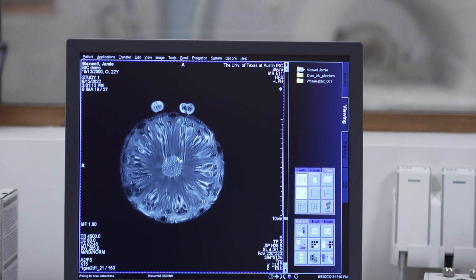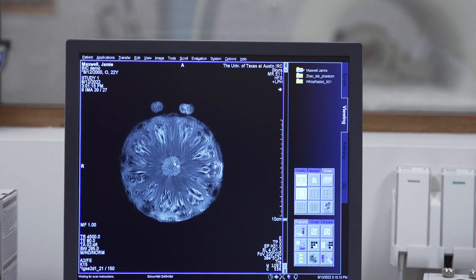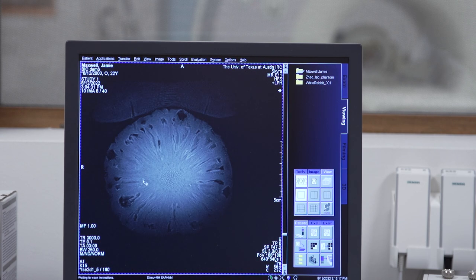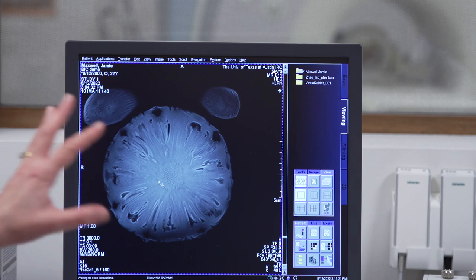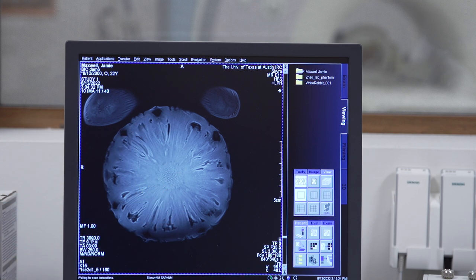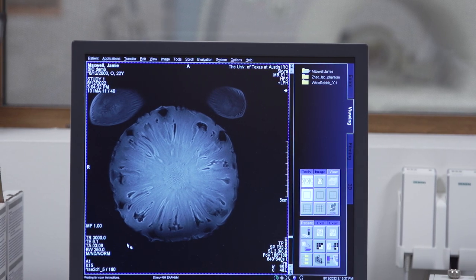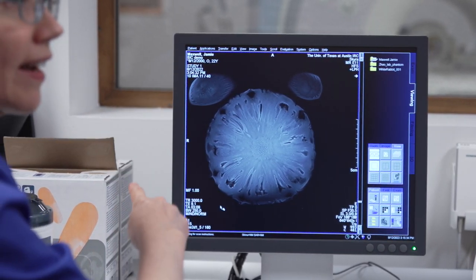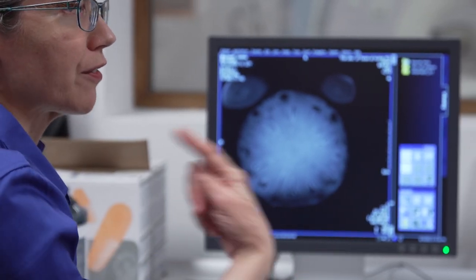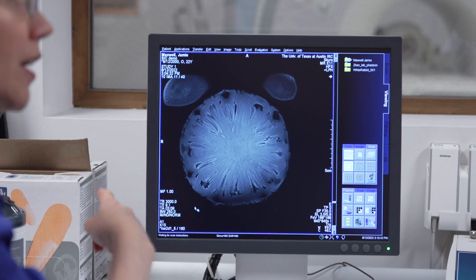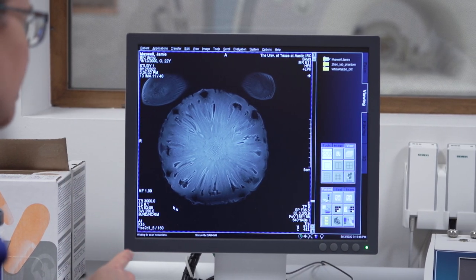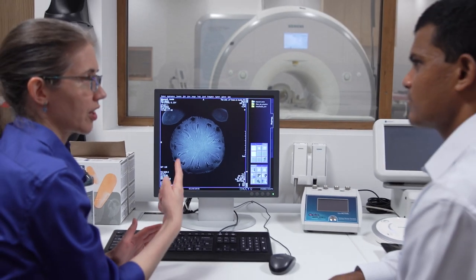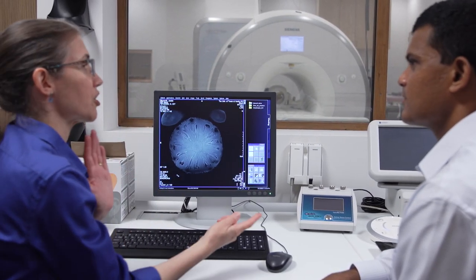It still has that swirliness to it. This is the T2-weighted sequence, and here is the proton density weighted sequence. It has a very short echo time and still a long repetition time, allowing the protons sufficient time to relax back to being realigned with the main magnetic field before the next radio frequency pulse tips the spins away, while also performing a very fast image before the protons have a chance to finish relaxing and finish decaying their signal.